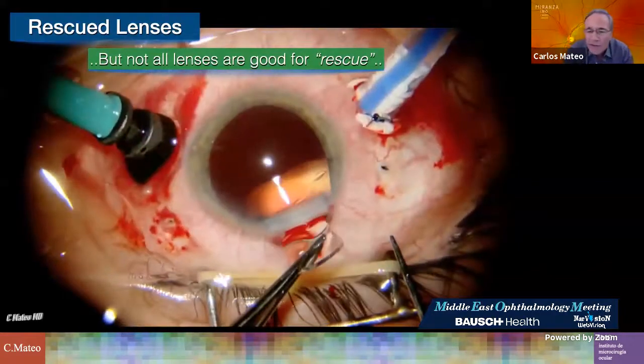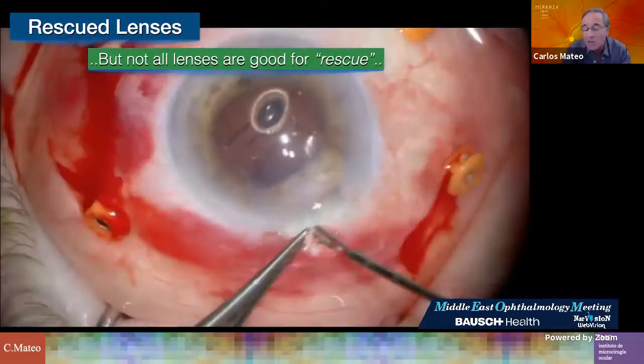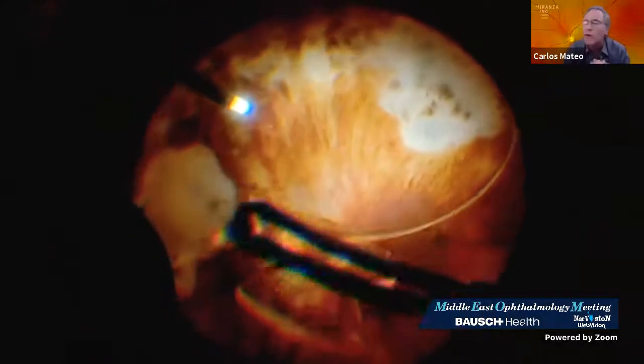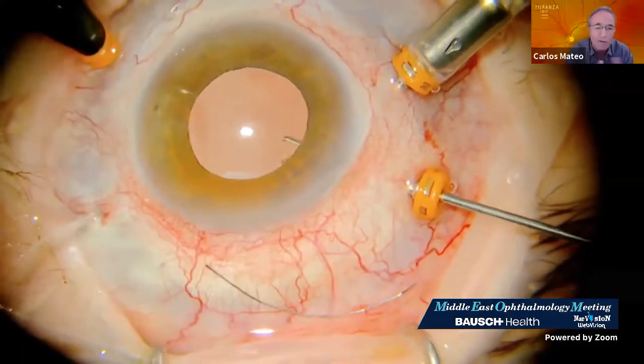Evidently, not all lenses are nice for recovery. These silicone lenses, for example, are not good for recovery, and you have to remove them. I have two or three techniques, but one of the most used techniques at this moment is the iris suture. There are some surgeons who prefer not to remove all of this, but I remove everything. I remove the cortical material, the capsules, and the ring.